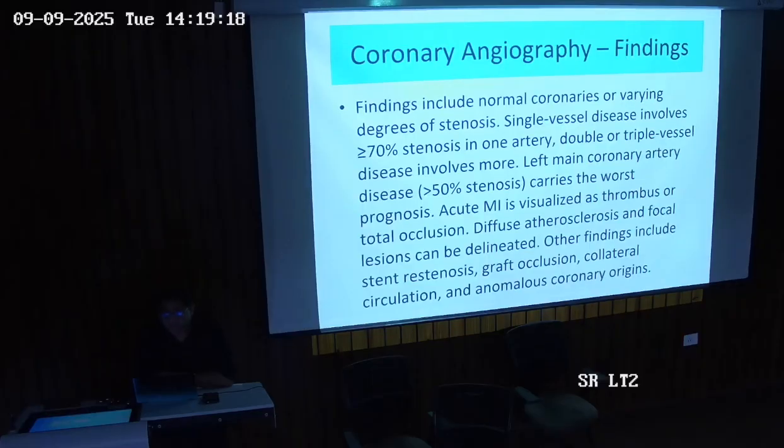Along with this, if a collateral is formed, in that condition we can decline stenting or CABG, since collateral circulation has already formed. Third, a graft that is already done can be occluded, and can be detected by the CAG. A patient comes to you with chest pain again after CABG, two years back. The patient has a history of a graft, so definitely there is suspicion of occlusion.